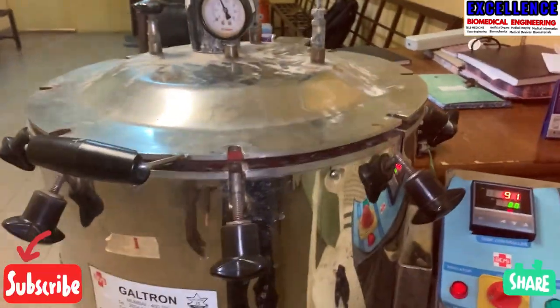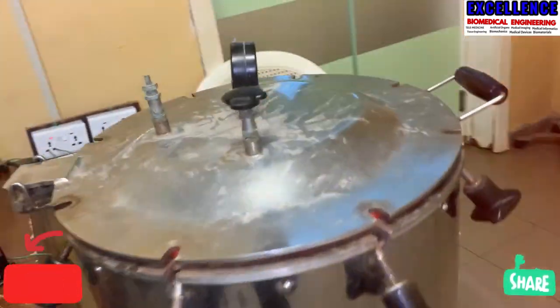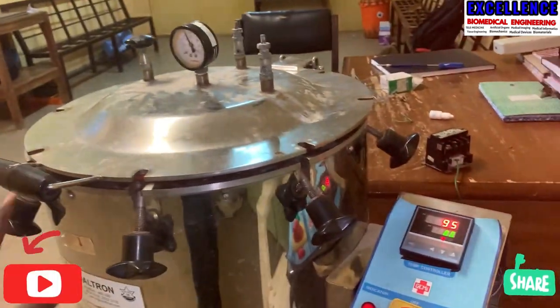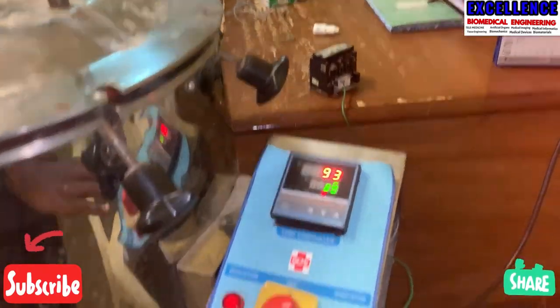Hello everyone, welcome to Excellence Biomedical Engineering. On today's video, I'm here with this sterilizer — this is a steam sterilizer, also referred to as an autoclave. It is used for sterilizing all the equipment, especially metal equipment which is used for operations, that is surgery, or used in the OT.